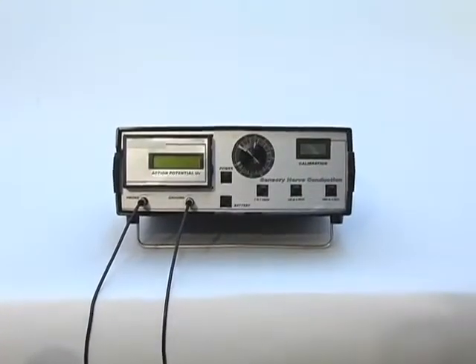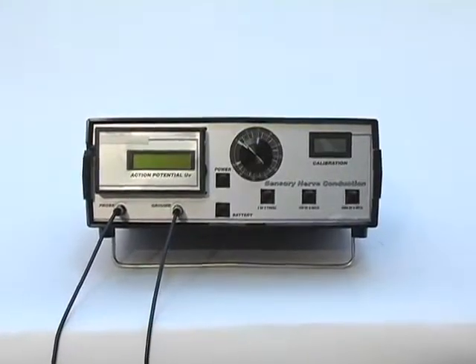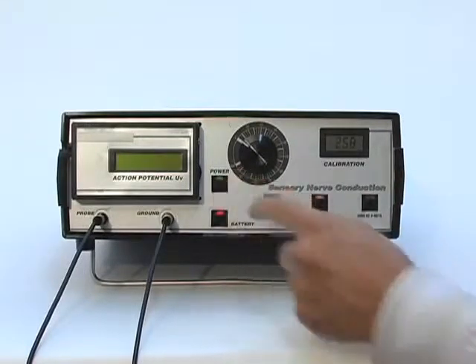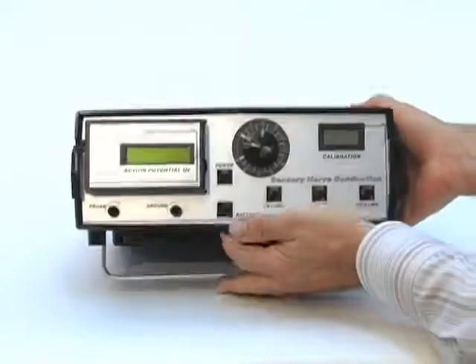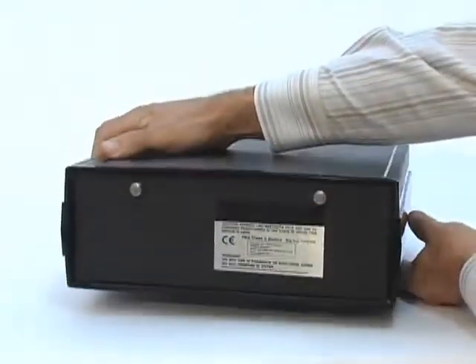If the cotton tip and ground sponge are placed correctly, but the patient does not feel the stimulus, the problem may be with the batteries or cables. Check to see if the batteries are loose or the door is closed incorrectly. If the red light on the front is flashing, it's time to change the batteries. The battery compartment is located in the back of the device.